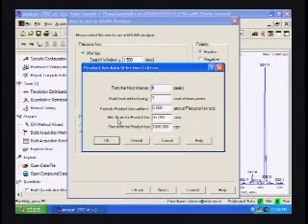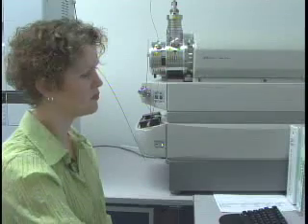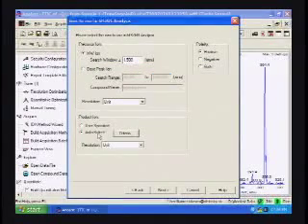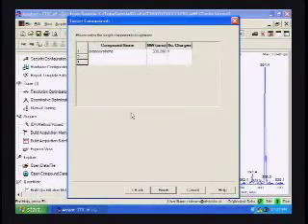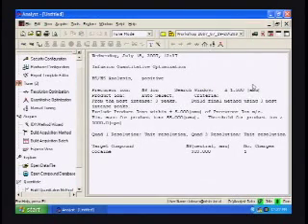You can also tell it a minimum mass for the product ion. We use this section to exclude losses of water when we're actually performing the collision-induced dissociations. So 55 would be okay. So we'll just go ahead and use these parameters that are in there and go to the next pane. We're going to specify which compound we're using, which is cocaine, and its molecular weight, which is 303, and the number of charges. And then when we're finished, it's going to perform its functions for us.